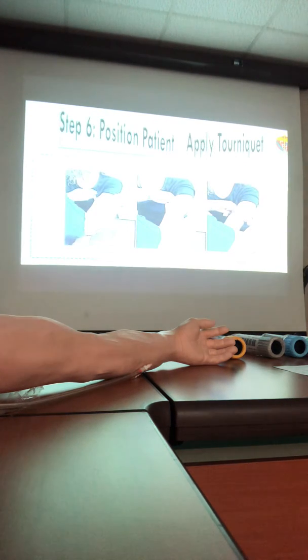Using PPE, I think everybody knows what the meaning of PPE is. Step number 6, position the patient and apply the tourniquet. Regarding the position of the patient, it depends on whether the patient is in the outpatient or the inpatient department. Okay, I mentioned it before.